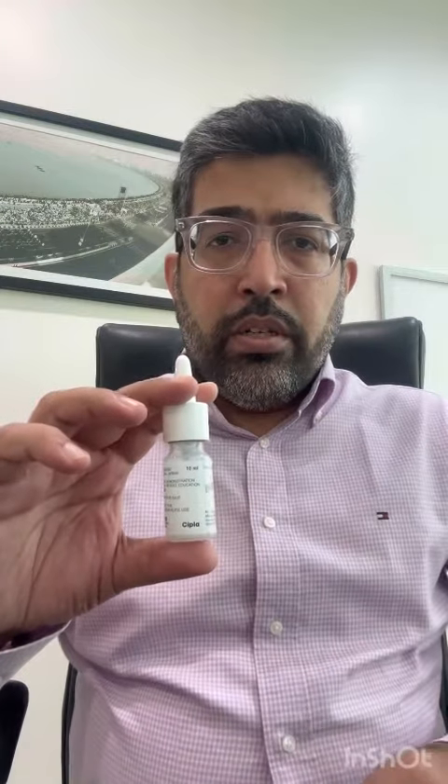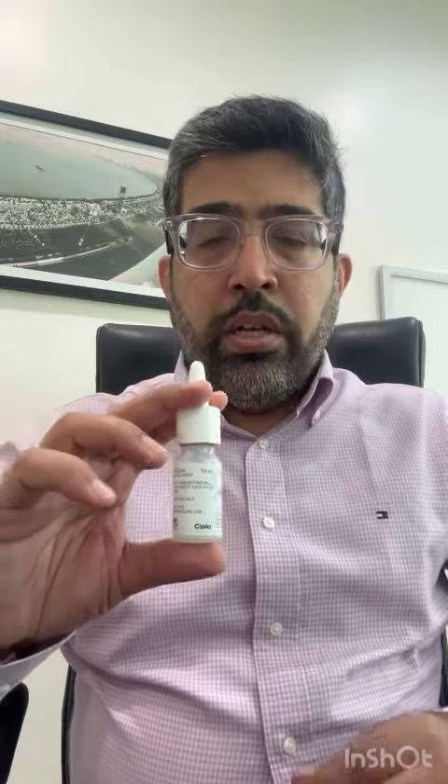This spray is supposed to be held with the thumb at the bottom and two fingers on the top, pressing from below. If you use it the other way, you are not going to be able to put it completely inside your nose, so it's going to be difficult to use.